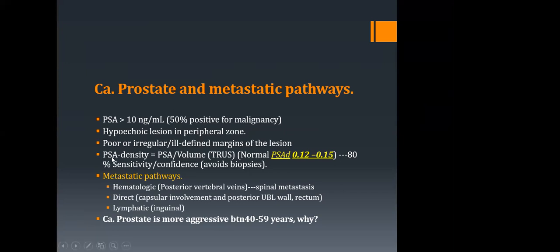Now we have this measurement, what we call the PSA density. This PSA density is 80% sensitive to CA prostate. And it gives confidence in avoiding biopsies.